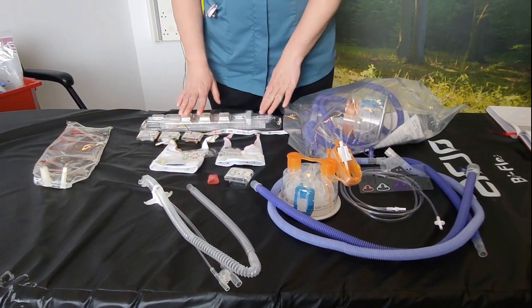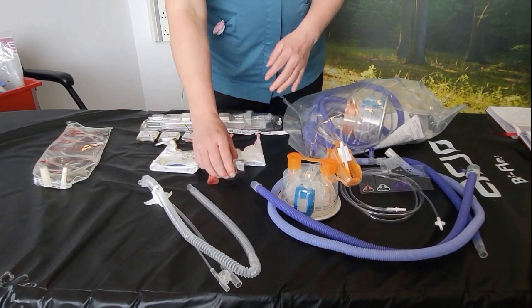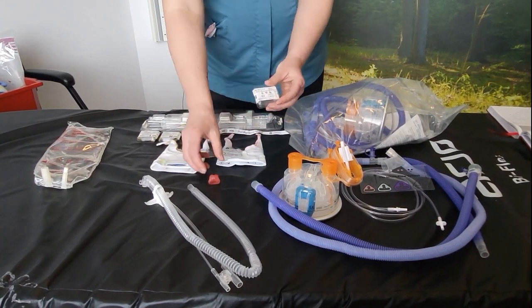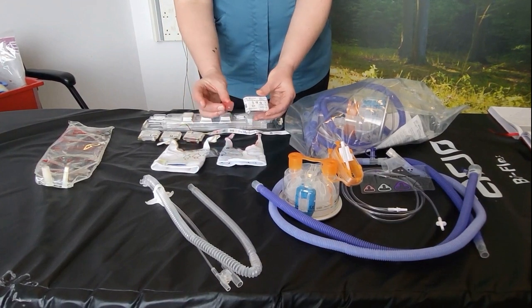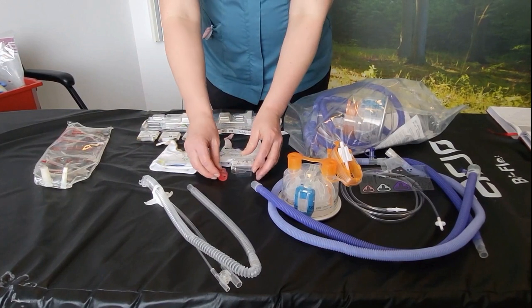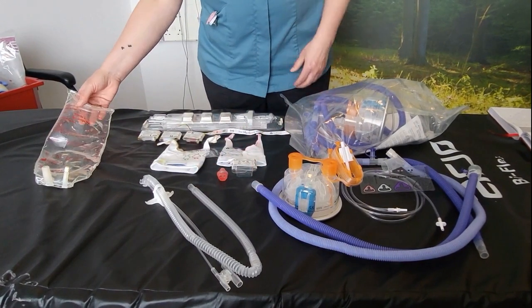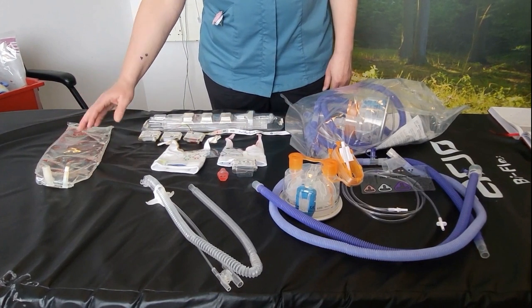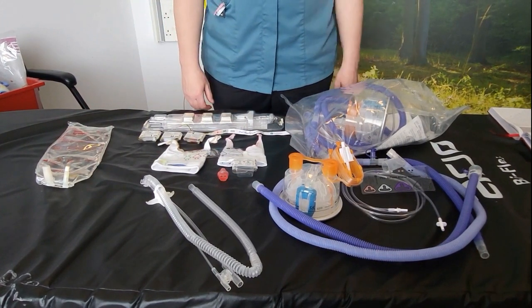The masks are not included in the generator set and they are ordered as individual packs in different sizes. This is just an example of a small mask which would attach to the end of your tubing. You would also need water for irrigation or water for inhalation to fill up your water chamber.